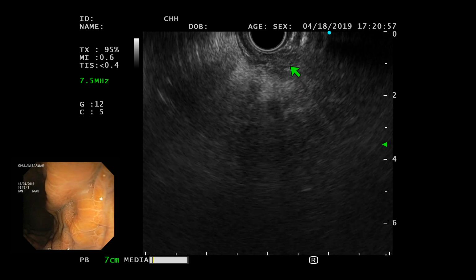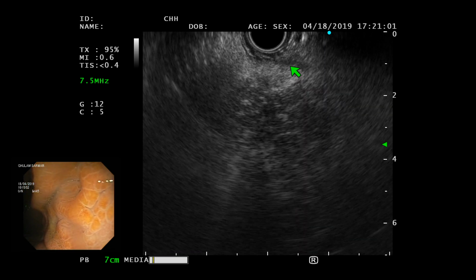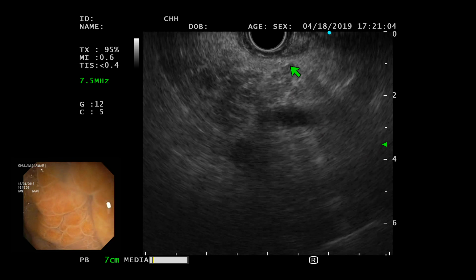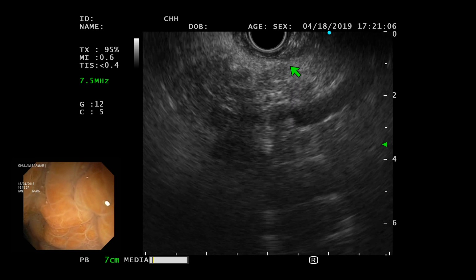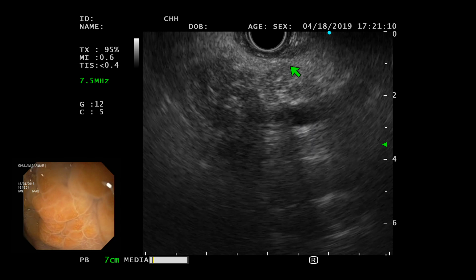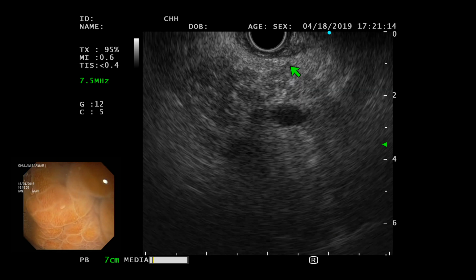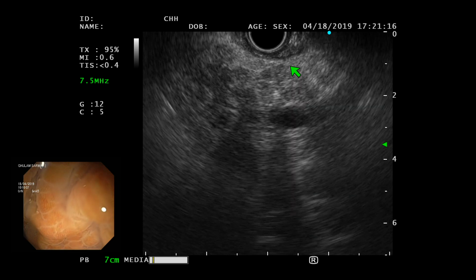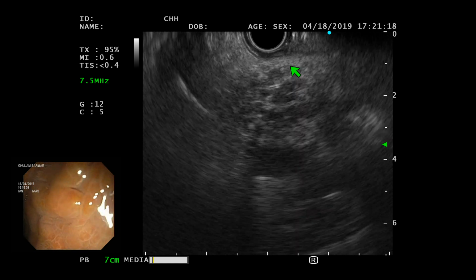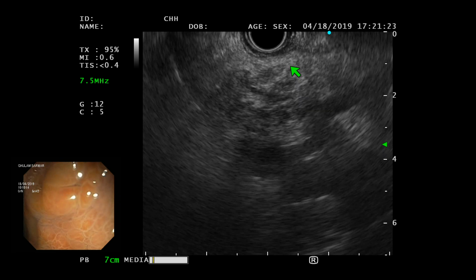When the pancreas comes to the center, big wheel a little bit towards you. Now follow the pancreas towards the tail. So what do you need to do? Yes, rightwards. Keep adjusting the scope to keep the pancreas right in the center. If the pancreas is moving to the left, you need to push the scope. If it moves to the right, you need to pull the scope. And just keep that in the center.